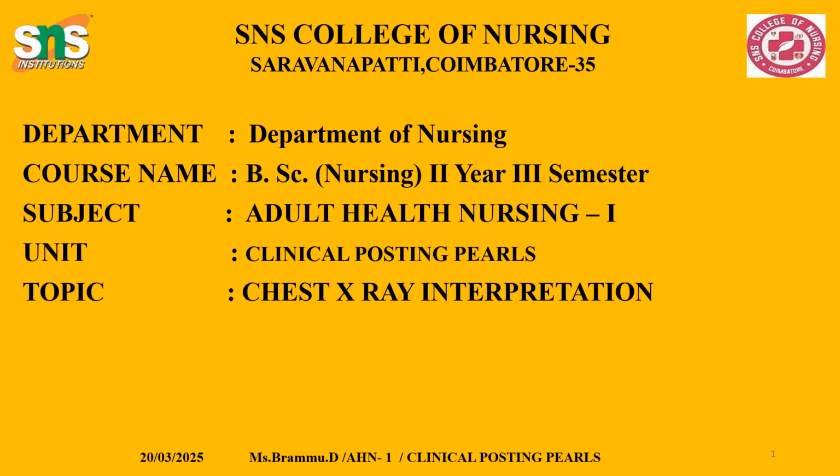Yes, the topic which I've chosen here is chest X-ray interpretation. Well, this may sound weird. Why do we need to know about the chest X-ray? Being a nurse, we need to read the chest X-ray as soon as we receive it from the patient side. Thereby, you can come to certain conclusions on how we can position the patient.